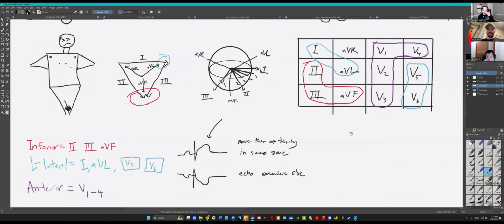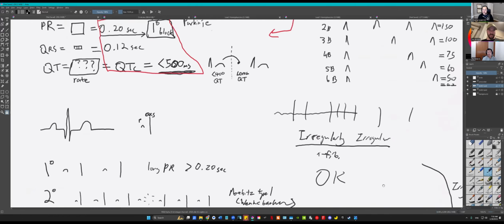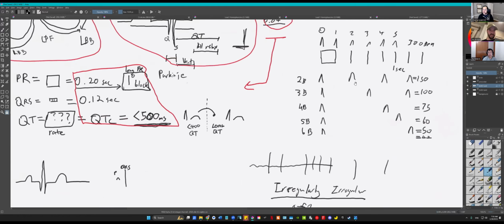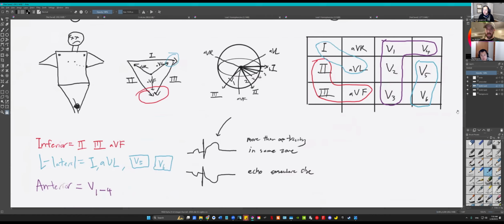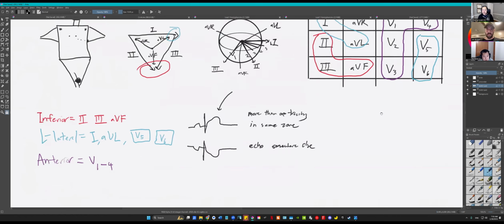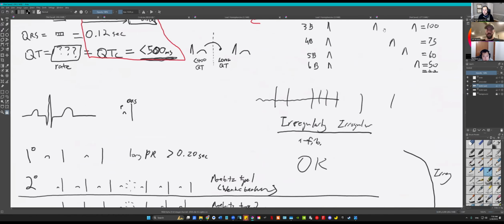So honestly, practically for you guys, this is probably useful if something's super tachycardic or super bradycardic, when it's hard for your eyes to pick out. Look up some examples on the internet. If you can remember this chart here, this is critical, because it will show you where all the zones of the heart are, and you can start training your eyes to look at EKGs in chunks. If you can be the early warning detection system, you will catch these faster than the attending will.